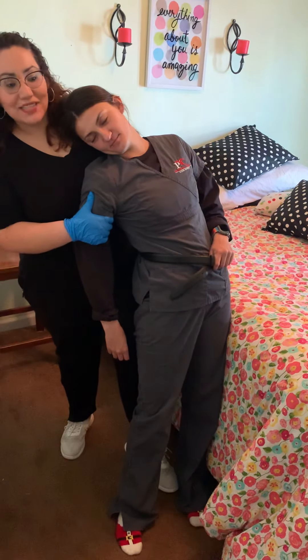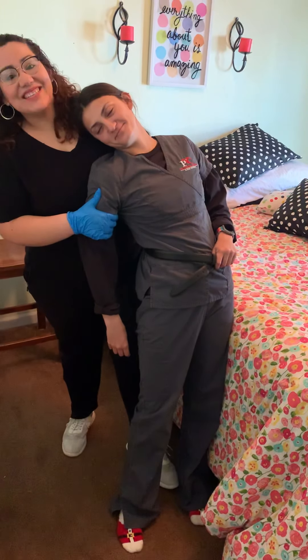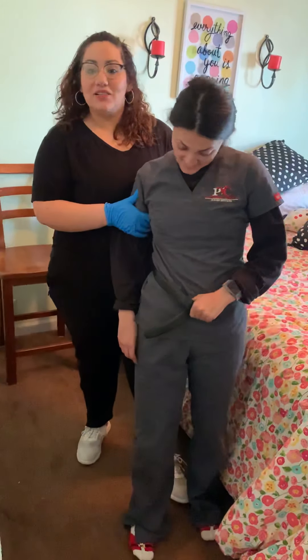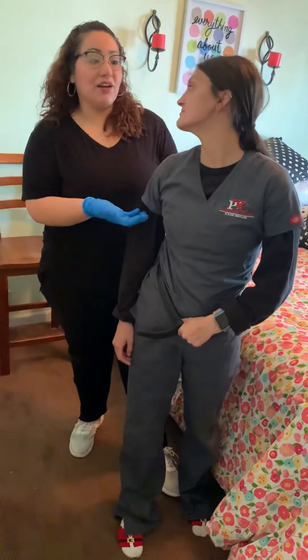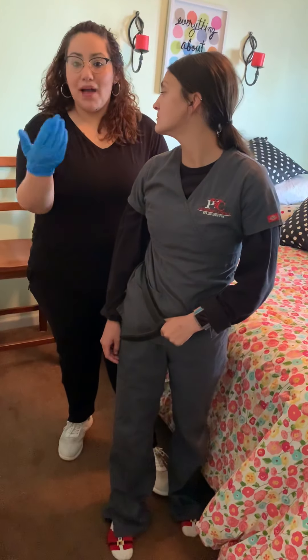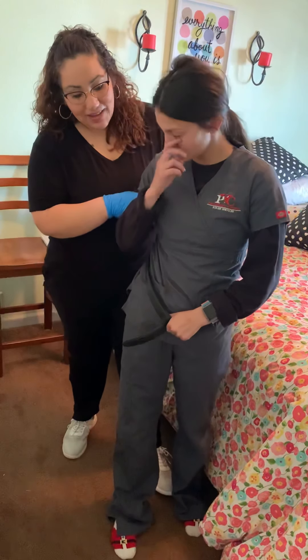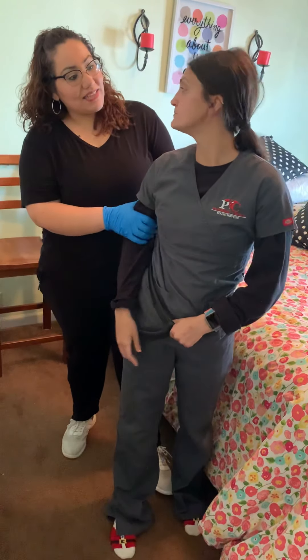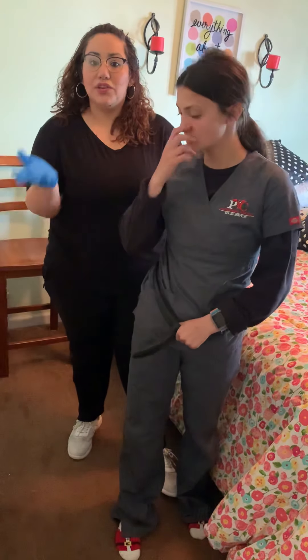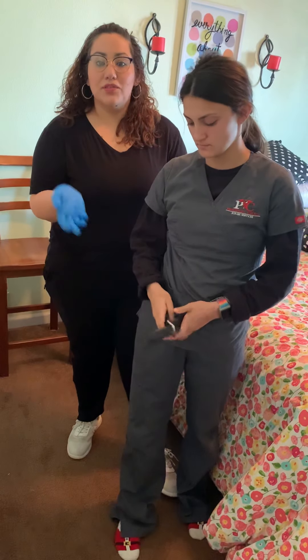We're going to turn you, and then we're going to walk. When you are walking, a patient can fall on you — that has happened. You have to know how to assist them with that. Ma'am, I think I'm falling. So if the patient starts to fall, do not try to prevent them from falling. Instead, put a leg in between, let them fall, and assist them to the floor. When they're on the floor, ask them if they're okay. Are you okay? She's okay.